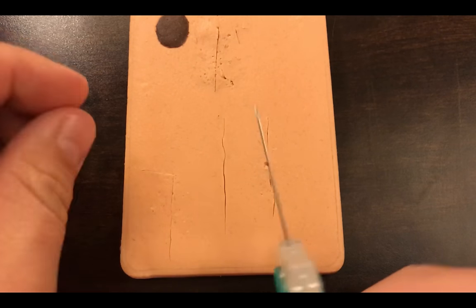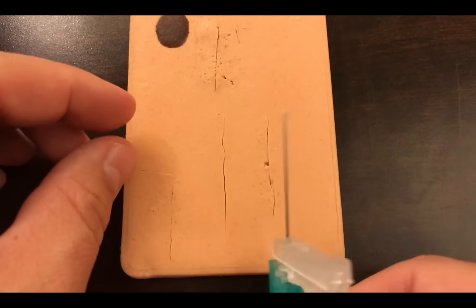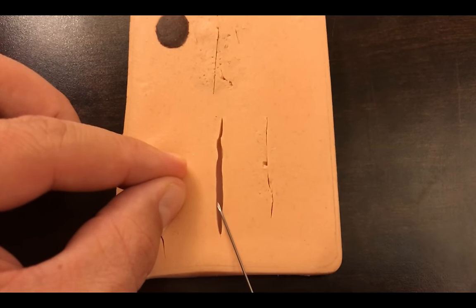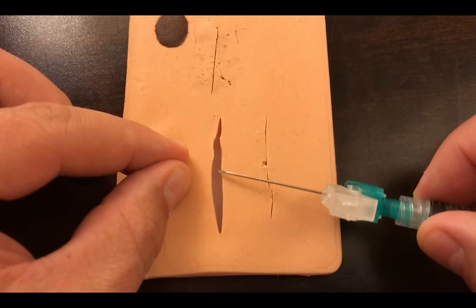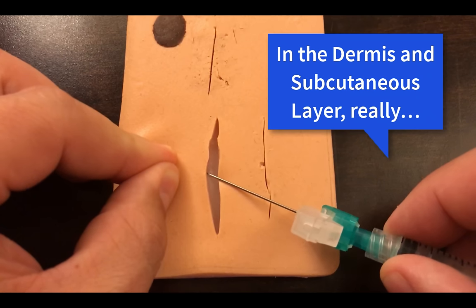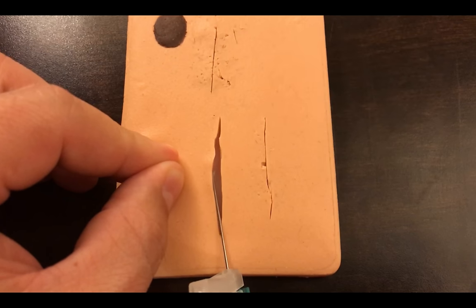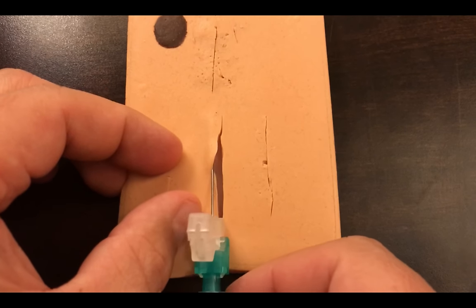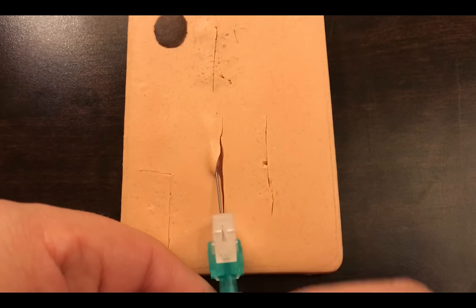Let me demonstrate both approaches. Depending on the size of the laceration — this one is roughly the same length as my needle — I can cover most of it from one entry. For demonstration I'll start about halfway in the middle. I'm going to go bevel up just underneath the epidermis into the dermis, and position my angle so I can advance the needle through the tissue up towards the apex.